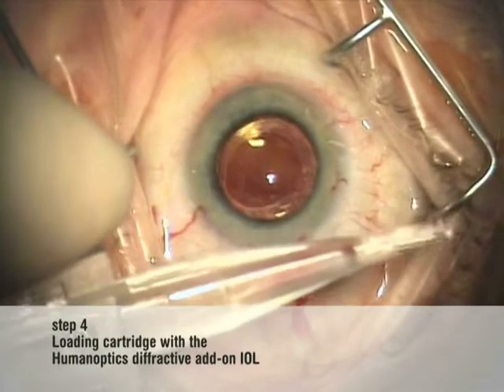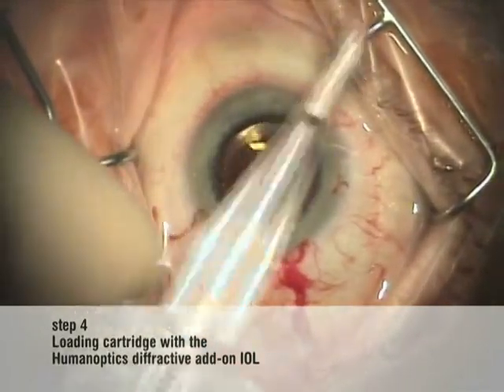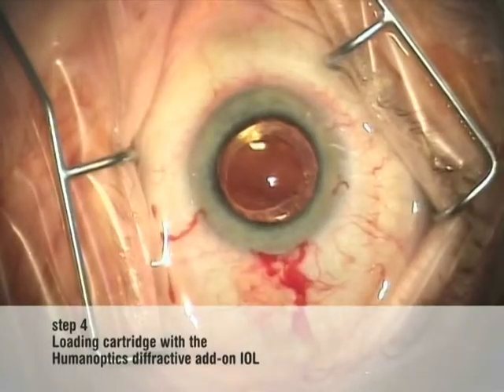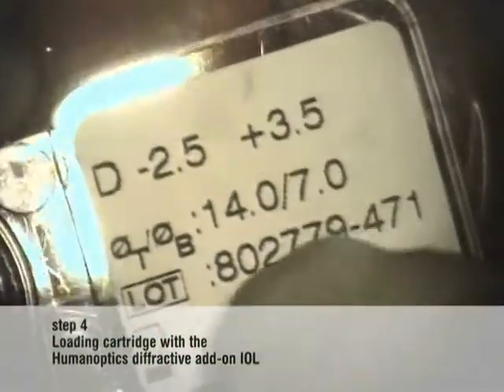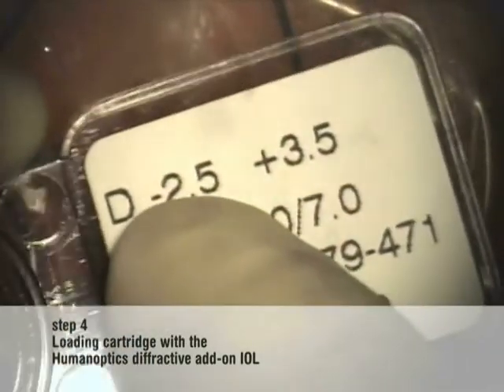The add-on IOL has two features in this case. In the first place it corrects the refractive error for distance — 1.75 D, corresponding to minus 2.5 D in the IOL plane — that has remained after cataract removal and IOL implantation five years ago.